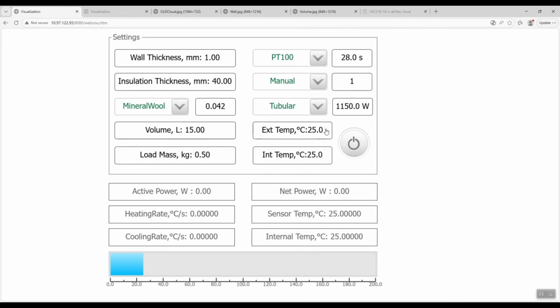The 10th parameter is the initial actual temperature inside the sterilizer chamber, which is also necessary for implementing the physical model of the thermal balance. All the settings I mentioned are saved in non-volatile memory, that is, in the so-called retain area of the SPC210 programmable controller. This means that all the setting values will be preserved even after the controller is powered off.